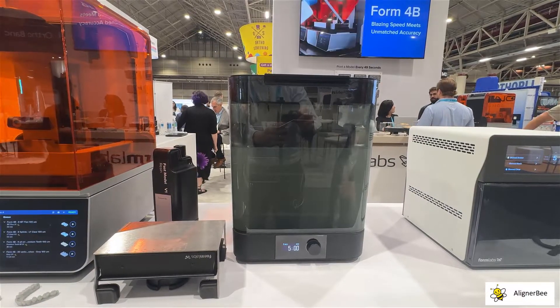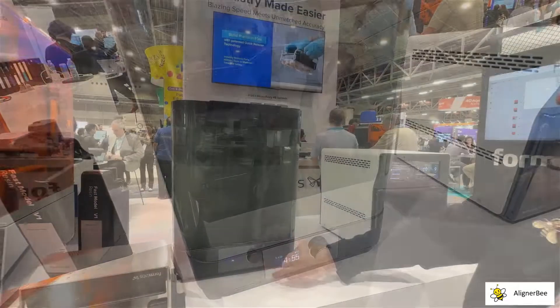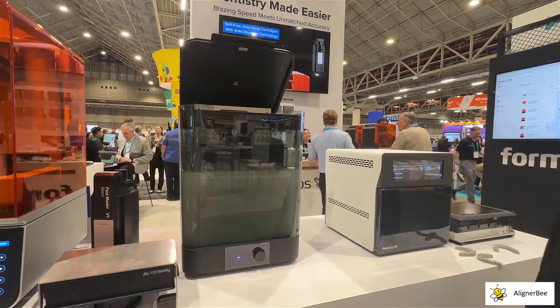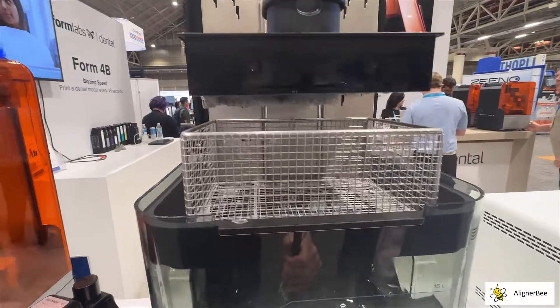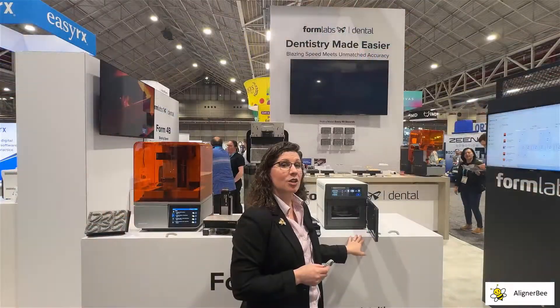Formlabs has an entire ecosystem designed around the new system. We have our Form 4B printer, the traditional Form Wash that I've used in my practice for many years, and a new light curing unit that significantly reduces curing times.